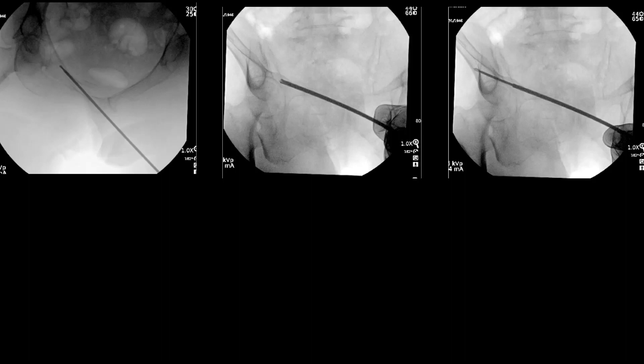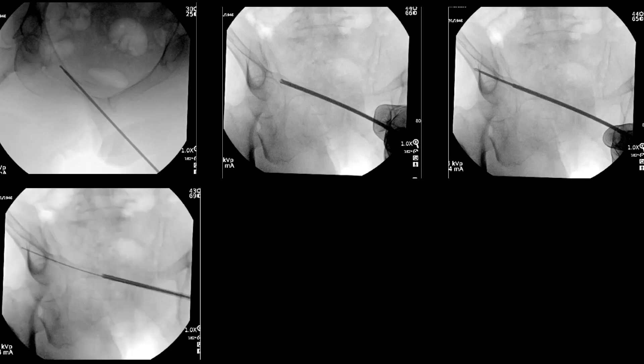I leave the drill bit in place and remove the guide wire. The key point here, which I'll reiterate later, is that I use the 450 millimeter guide wire so that I can leave the drill in place and still have the ability to retrieve the guide wire. I'll then place the Luminos flexible guide wire, and once that's in place I can remove the drill bit.